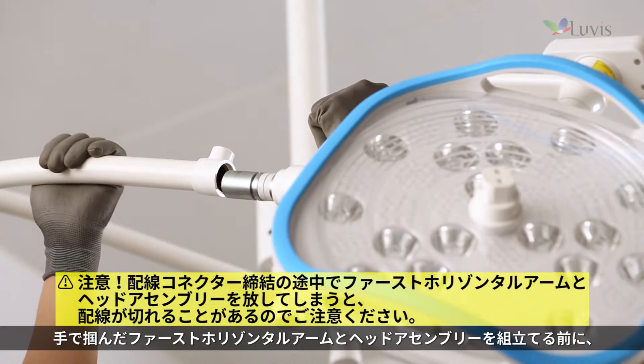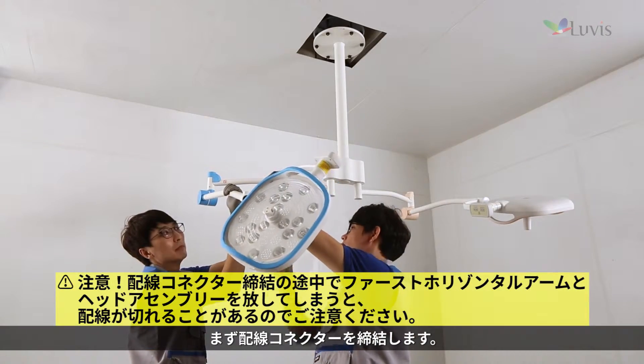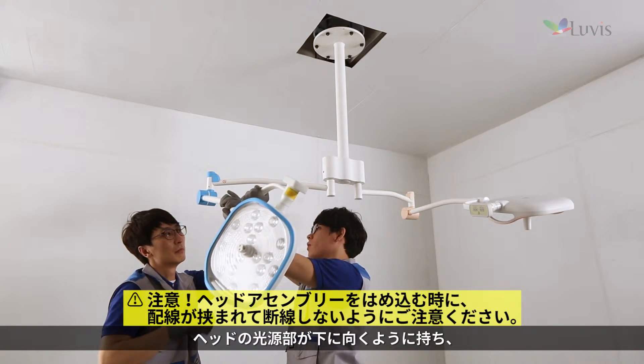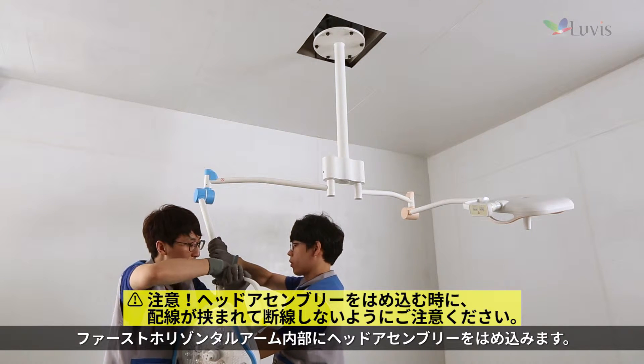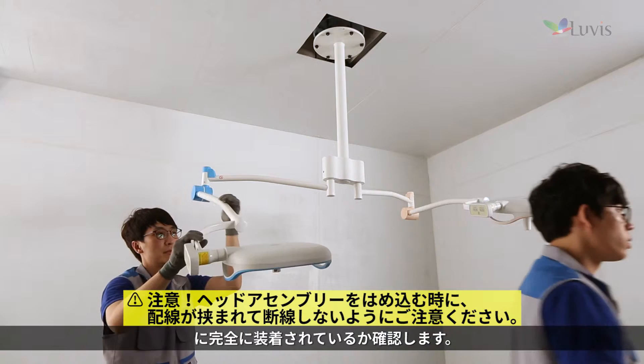Hold the installed first horizontal arm and lower it down. Check whether the joint arm groove and the first horizontal arm's head locking key groove fit perfectly. Tighten the wiring connector first to assemble the first horizontal arm and the head assembly. Hold the head with the lighting source facing down and insert the head assembly into the first horizontal arm.